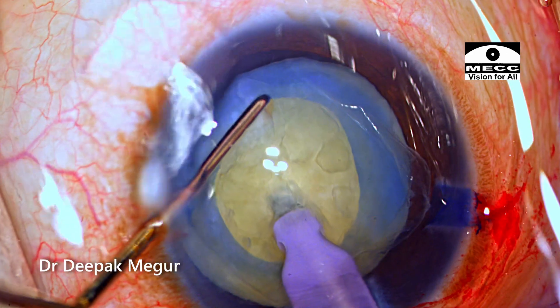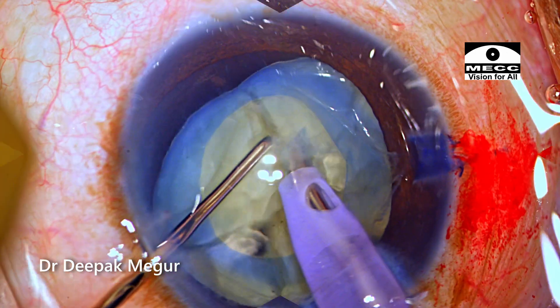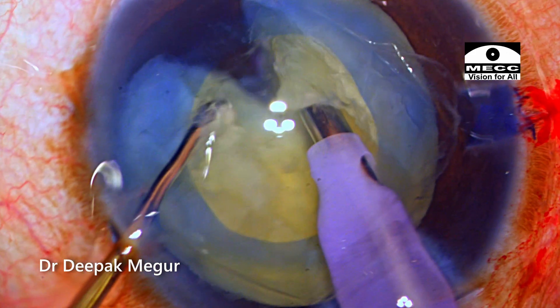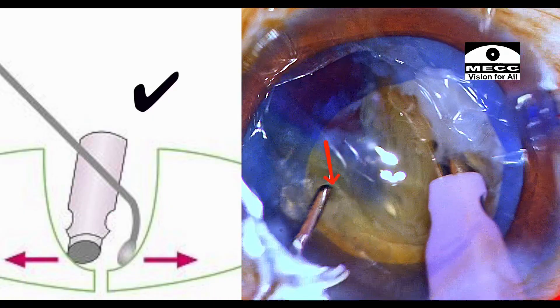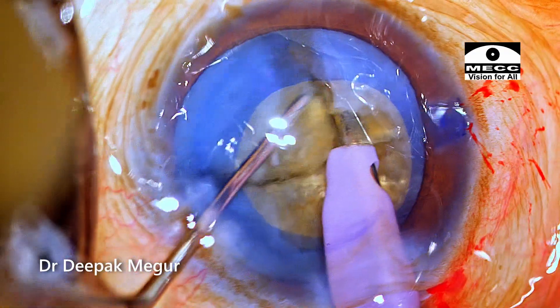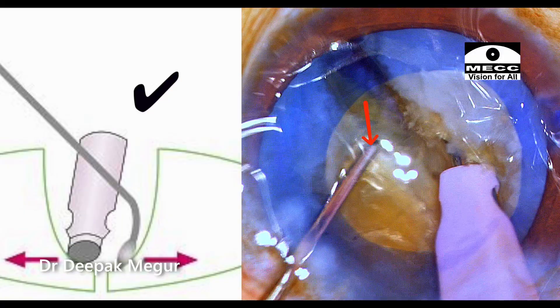To summarize: this was a discussion on the principles to follow when performing phacoemulsification in an eye where the rhexis is less than the ideal size. During chopping and lateral separation maneuvers, there is always a small risk that the rhexis can get damaged. The key principle is to ensure that the second instrument performing the chop and lateral separation is placed much more posteriorly — nearer to the posterior plate. This ensures very little energy is needed to divide the nucleus, and there is hardly any lateral movement that could stretch and damage the rhexis margin. This one principle of placing the second instrument deeper during lateral separation takes care of most of the problems.